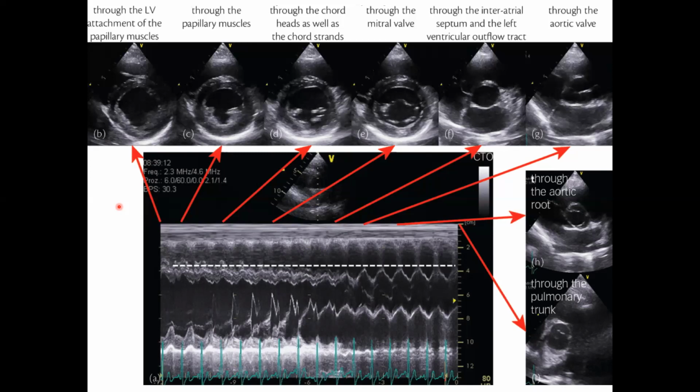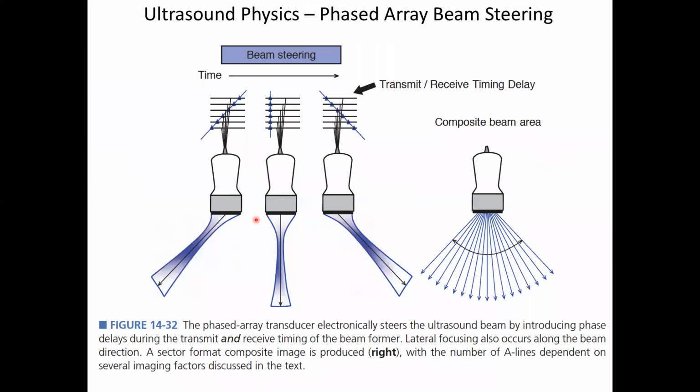When it ruptures, it's a big deal, right? Because you bleed out. So you kind of want to go in and put a stent in there. But you don't really want to do that until you have to. It's this balance, right? So images like that, very valuable. And ultrasound is used a lot in stuff like that.